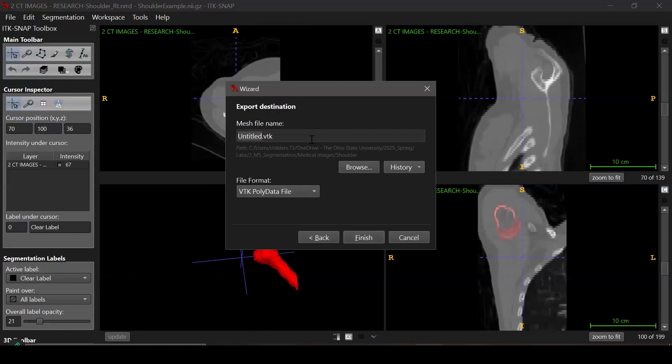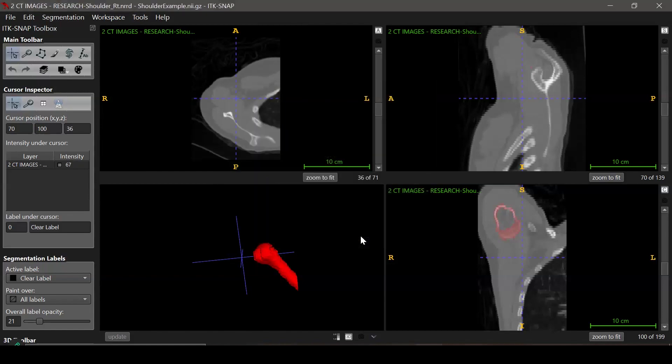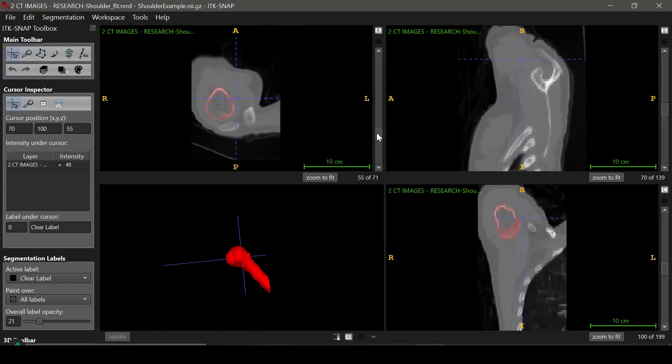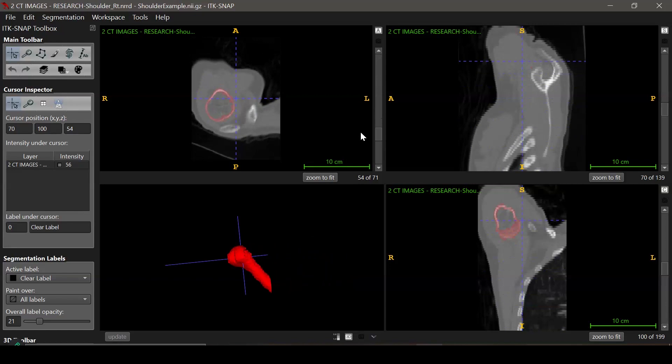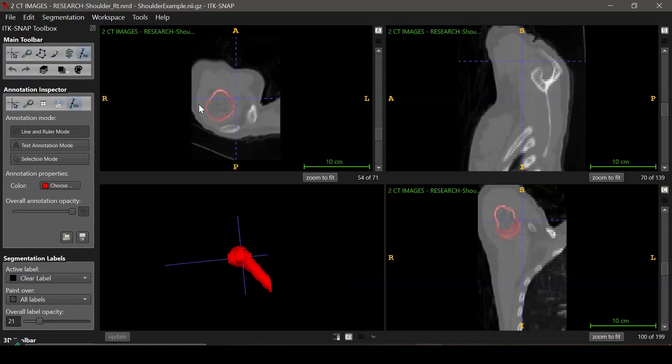When you are satisfied with your segmentation, you can export the 3D model. For this lab, we will use this model to make anatomical measurements. ITK-SNAP allows you to identify some dimensions, but the limitation is that you can only make measurements in the planes of the image slices.